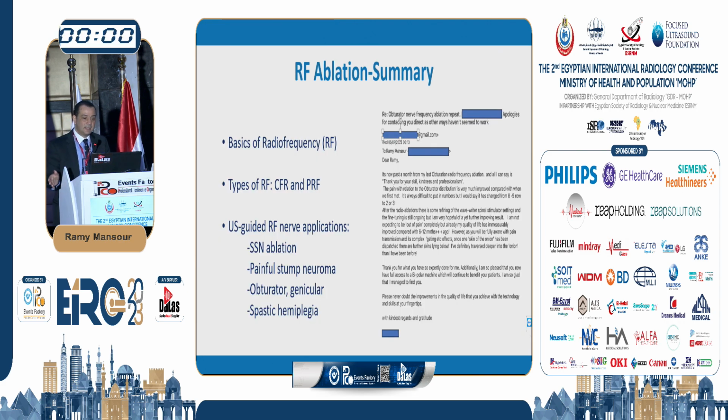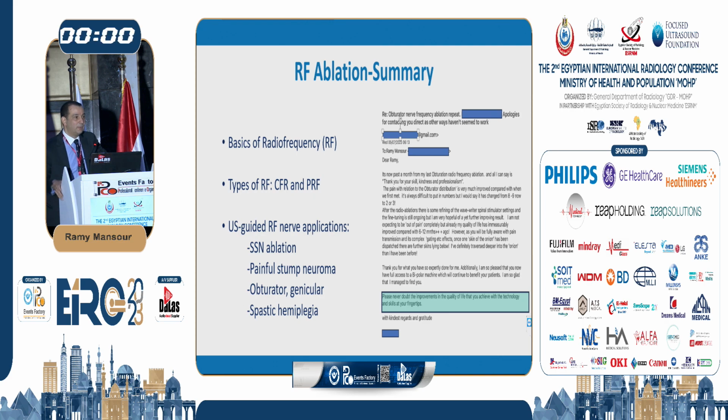And this is just a summary of my radiofrequency ablation. It works, and it can be used not just in the spine. We can use it in the peripheral nerve. I can just leave you with some of the feedback I got from one of the patients a couple of weeks ago about how technology can help our patients.